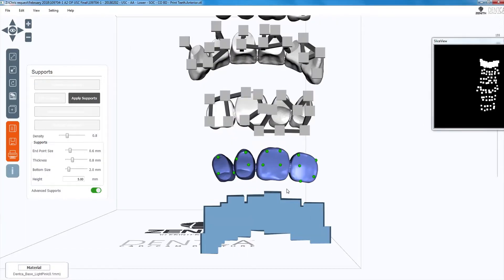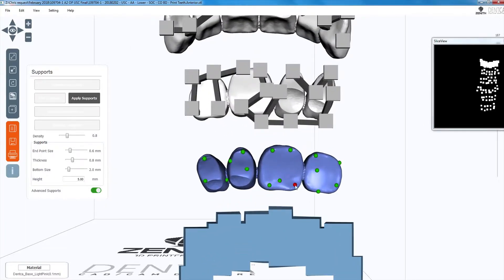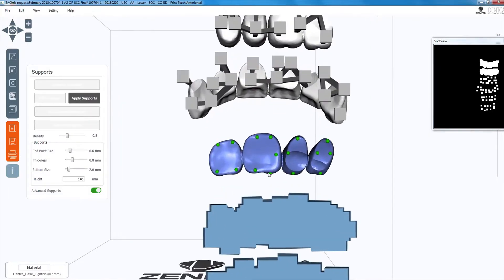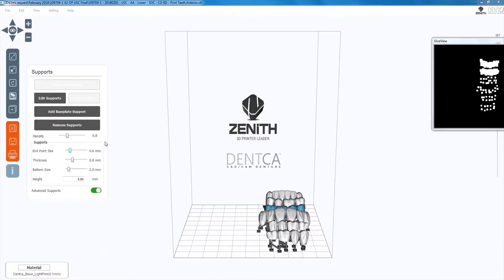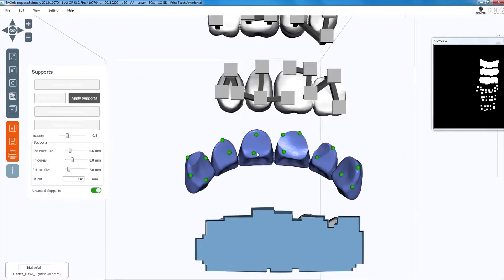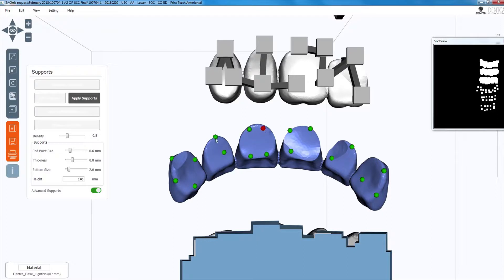As for the posterior teeth, ensure the supports are evenly spread around the border of the base, adding extra supports as needed. Molars should have around 5 supports and premolars should have around 4 supports. The maxillary anterior teeth should have 4 supports per tooth, with one additional on the distal of the canine teeth.